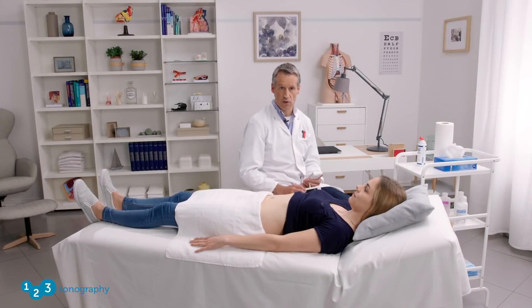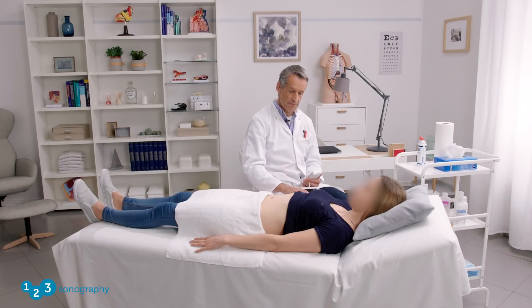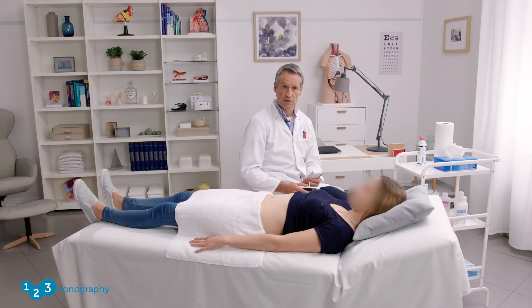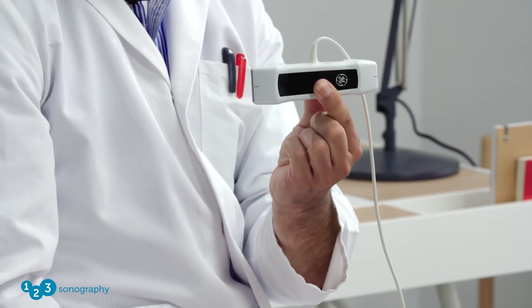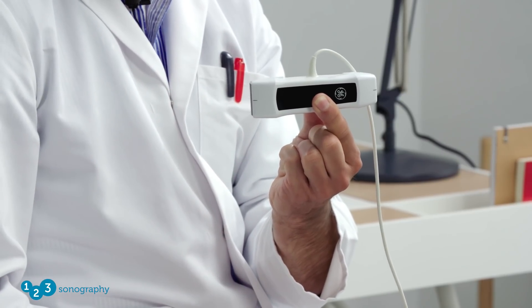Now I want to show you how to visualize the gallbladder and the bile duct with ultrasound. The best way to scan is in the morning, because after a fasting period during the night, the gallbladder is totally full and there is no bowel gas to interfere with the ultrasound. You don't need any special position — if the patient is lying in a supine position, the gallbladder and the bile ducts are scannable very easily. In this case, we are using a handheld ultrasound device. The probe has two sides: the linear side and the sector. For the abdominal scan, we use the sector scan.